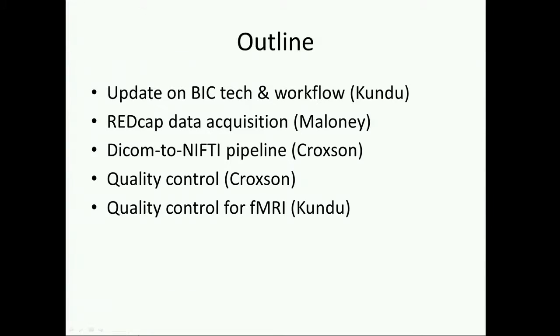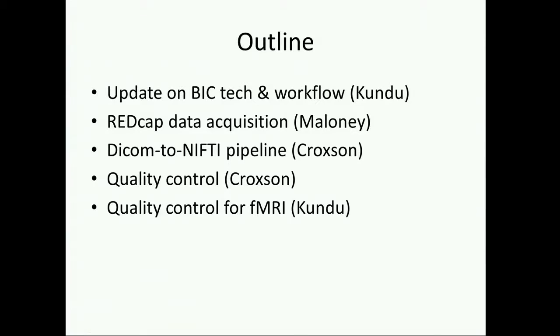We'll have short presentations from Tom Maloney, who will be talking about the REDCap system of data acquisition. Importantly, this is actually demographic data acquisition, and that's an important part of this, and we'd like to introduce that at this meeting. Then we'll talk about the DICOM to NIFTI pipeline that's implemented on XNAT now, as well as Paula Croxson will discuss structural imaging artifact detection that you can do by eye. I'll be talking about quality control for fMRI using metrics that are now implemented on XNAT. And then we'll wrap up with some general recommendations.